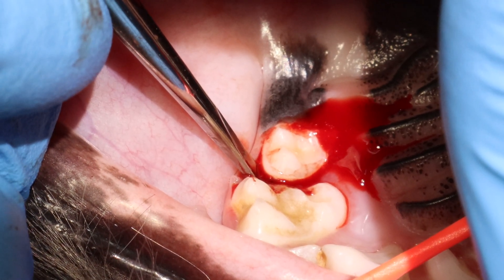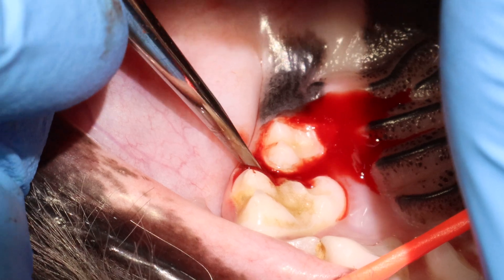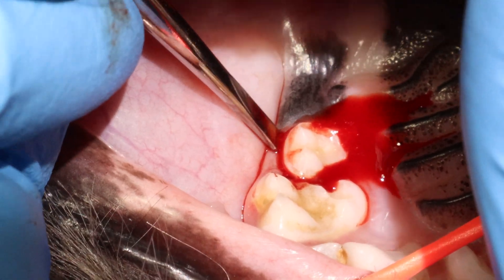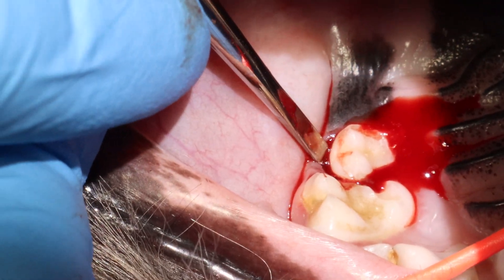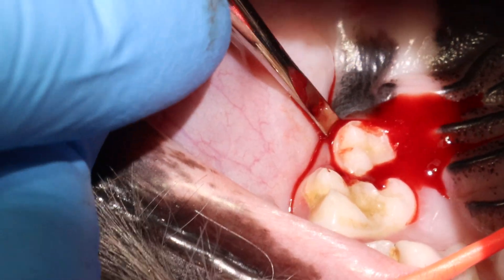I like to keep these dogs in dorsal recumbency, because I can really see what I'm doing, and it's much easier that way. I prefer having them in dorsal recumbency.